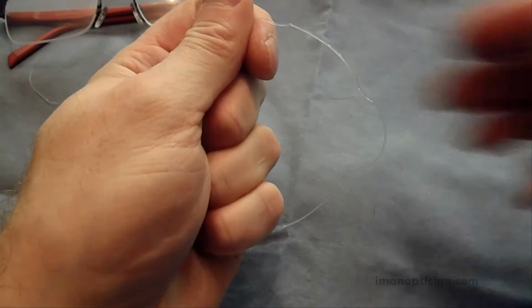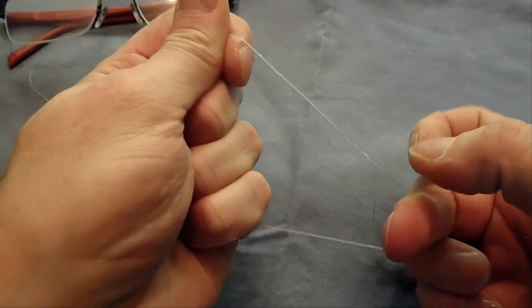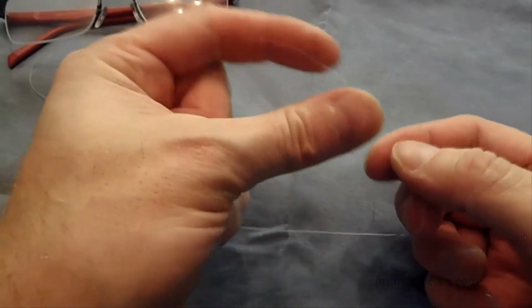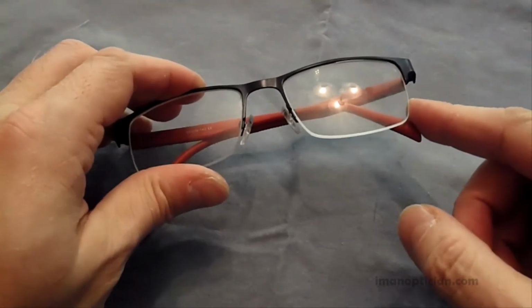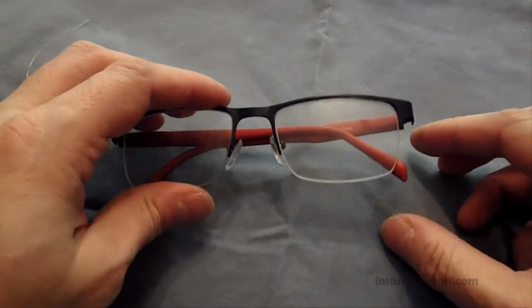You can do that with the lens right in there, but I usually don't suggest it with the lighter, because you can actually burn this. But if you have your frame warmer, it's easier, more even, and it does a much nicer job of it. But you can shrink that quite a bit. So there you are, a restrung frame in a very short amount of time, and very easy to do with minimal tools.